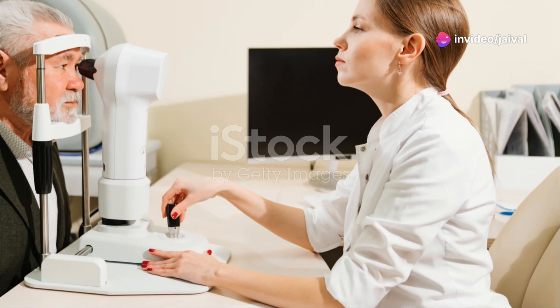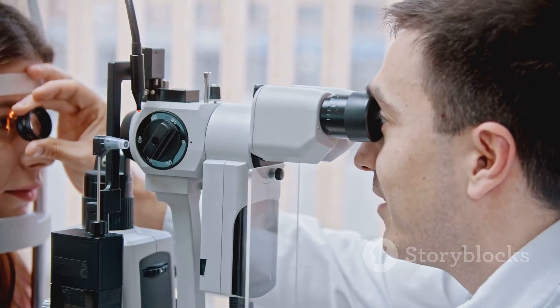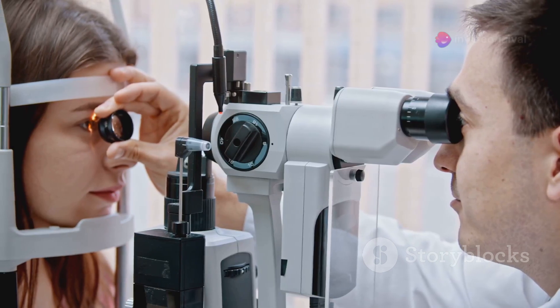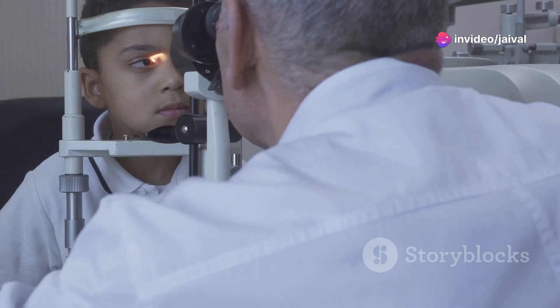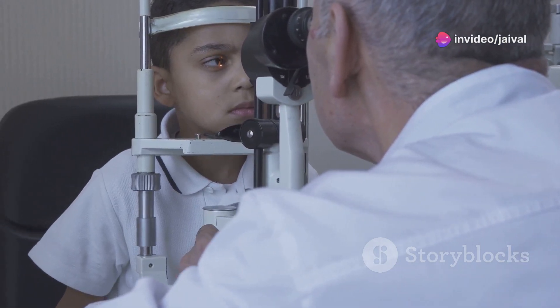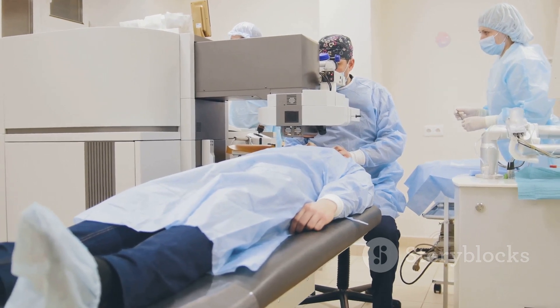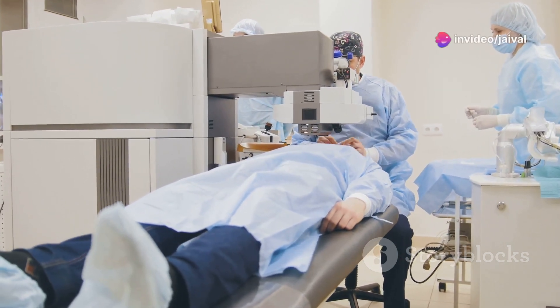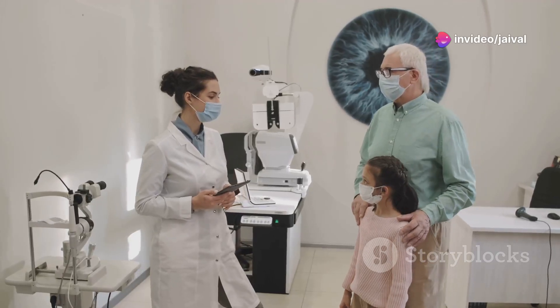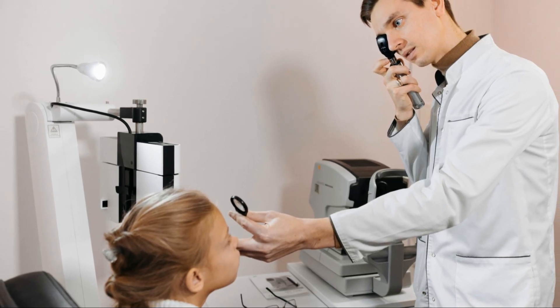Gonioscopy is pivotal in diagnosing and managing glaucoma. It helps understand the underlying mechanism and enables tailored treatment. In open-angle glaucoma, it confirms the diagnosis and assesses severity. For angle closure glaucoma, it differentiates between appositional and synechial closure. Gonioscopy findings influence treatment decisions — medications, laser trabeculoplasty, and surgical interventions are guided by gonioscopy. It plays a critical role in every stage of glaucoma management and remains indispensable for ophthalmologists.